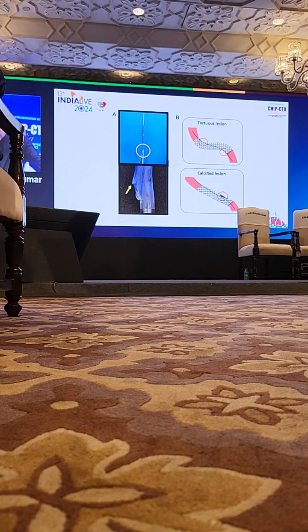I'll show you. So the issue is, where does it get stuck? It gets stuck in the exit port. So if it's a tortuous lesion, because of the layout like this, it gets caught here. And if it's a calcified lesion, it gets caught in the calcium.